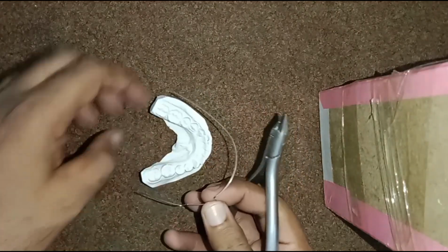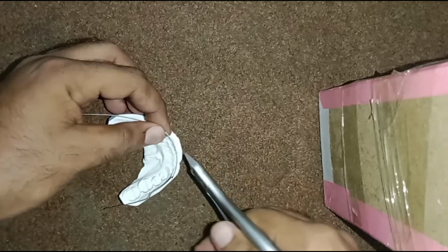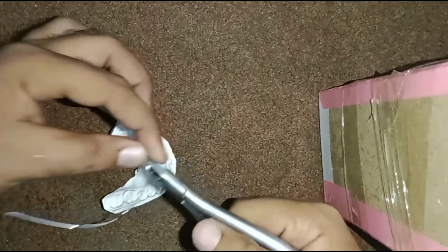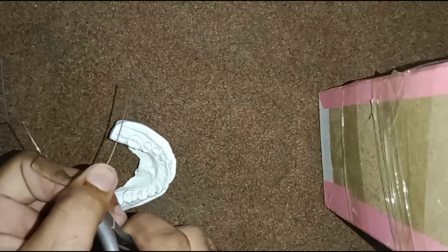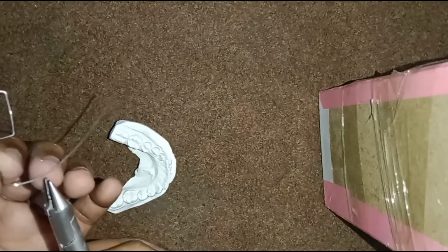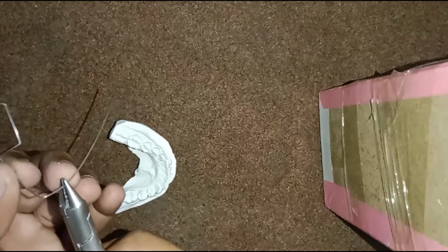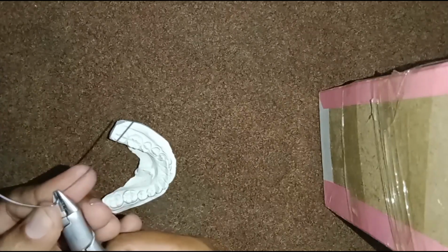Similarly, on the other side, we will place a mark distal to the lateral incisor, measuring on the cast. Hold the wire on that mark, place a downward bend of 90 degrees. Then at 6 to 7 mm, we will place another 90-degree bend.